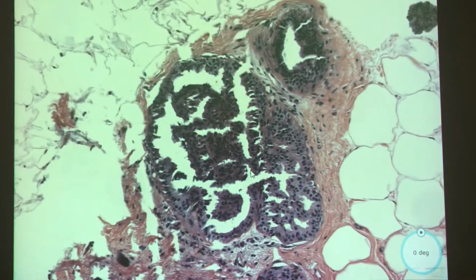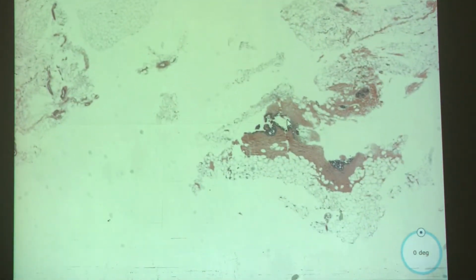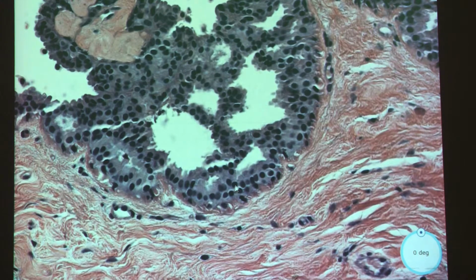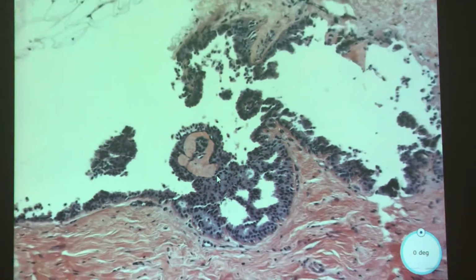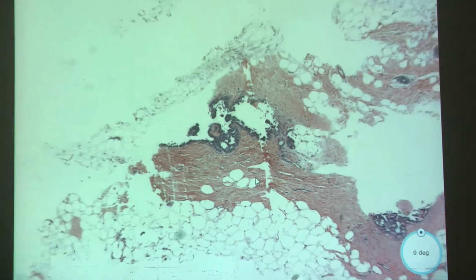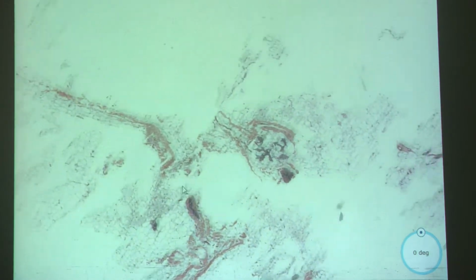Okay. There is one other little piece that's easier to find if you're at low power, because it's towards the bottom of the slide. Just that tiny little section there, and it's more of that same stuff. This one, look at these, they just wrap around, little tiny beans. And this one, so atypical papilloma. I like that. I'm okay with that. Okay, and we'll just pretend we scanned the rest of the slide. That was literally everything to see on the slide, because there's a little bit of papillomatous stuff that fell off over there.